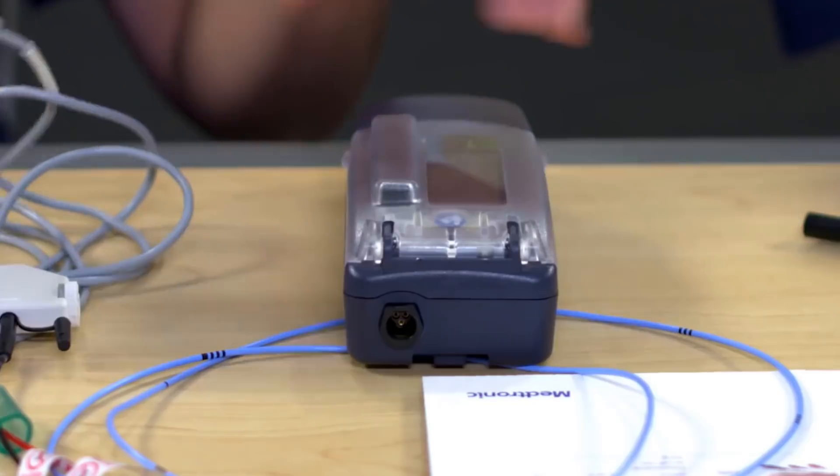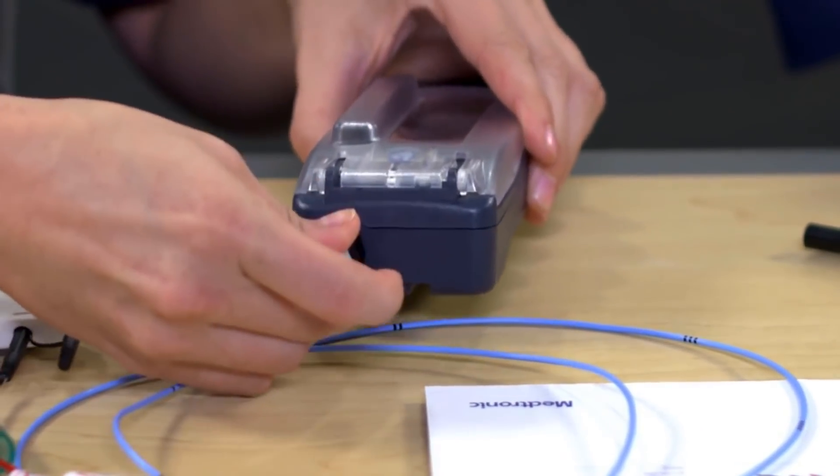Now you can connect the 5433 cable to the temporary pacemaker. That click indicates it's connected into the device. Just give it a slight tug to ensure the connection is nice and secure. No slipping here.